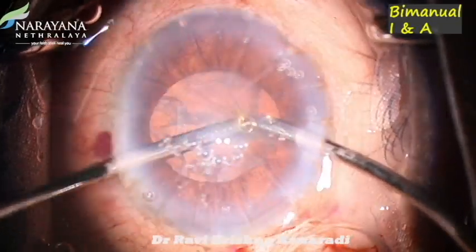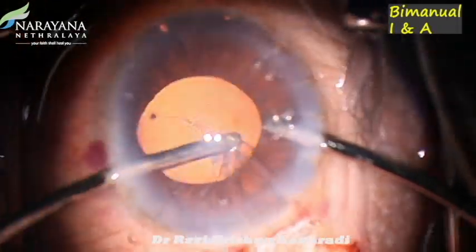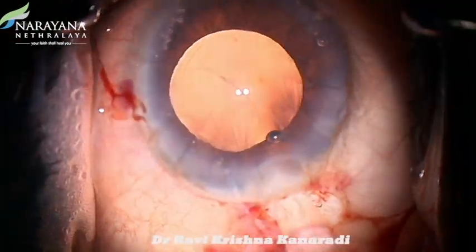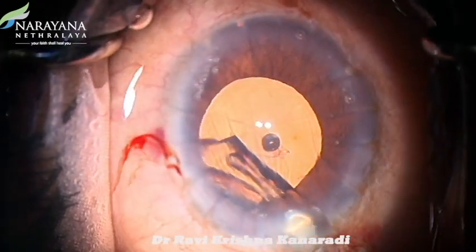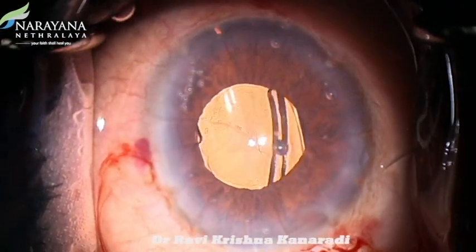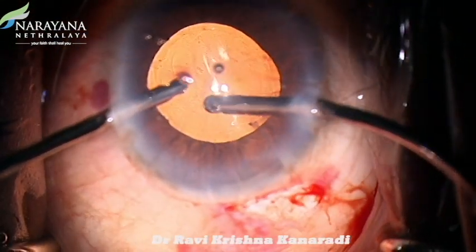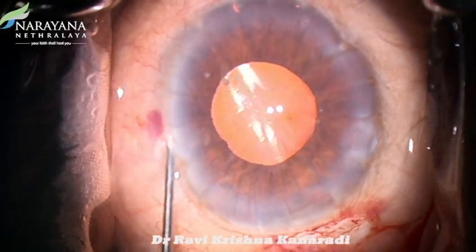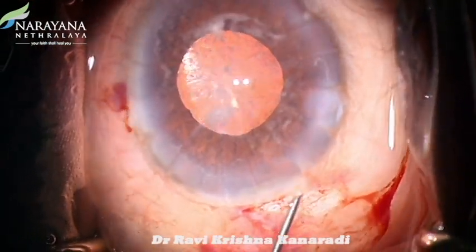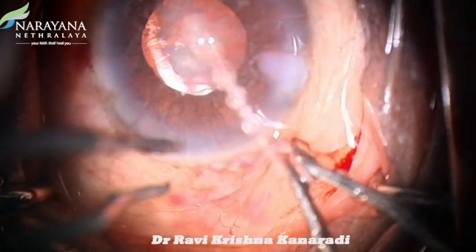Bimanual irrigation and aspiration is completed. A single piece foldable IOL is injected through the sclerocorneal tunnel. Wounds are hydrated and the conjunctiva is cauterized.